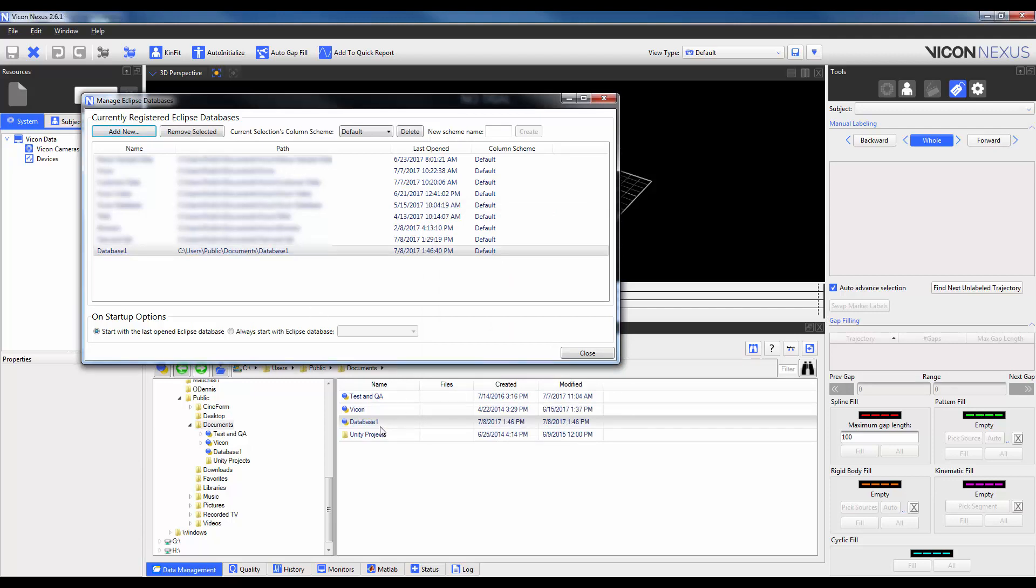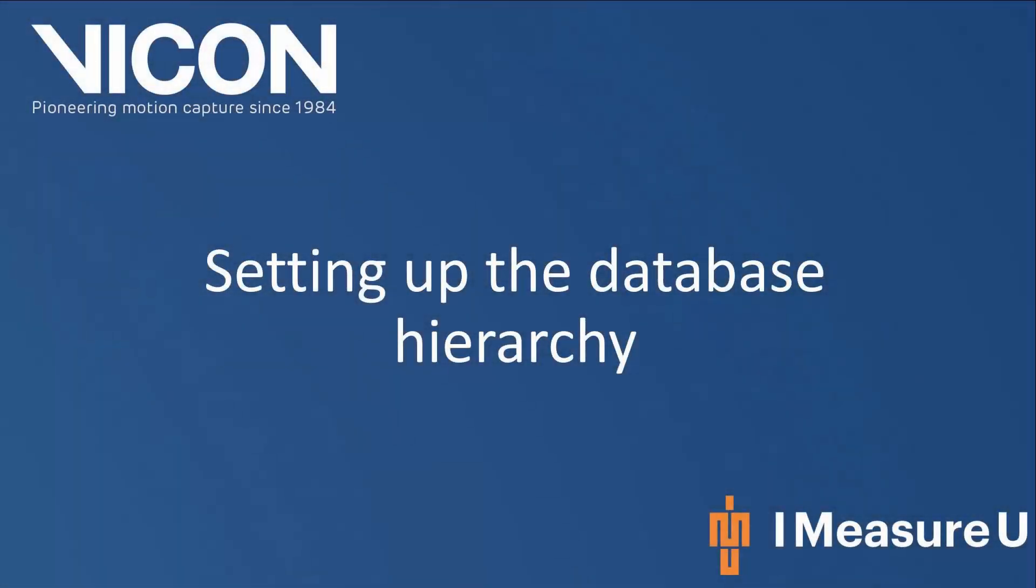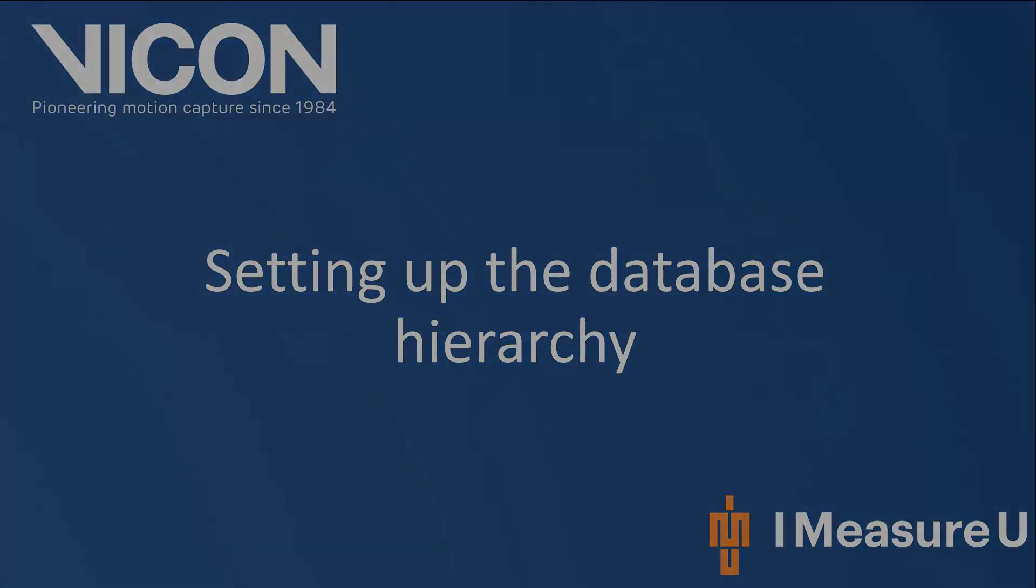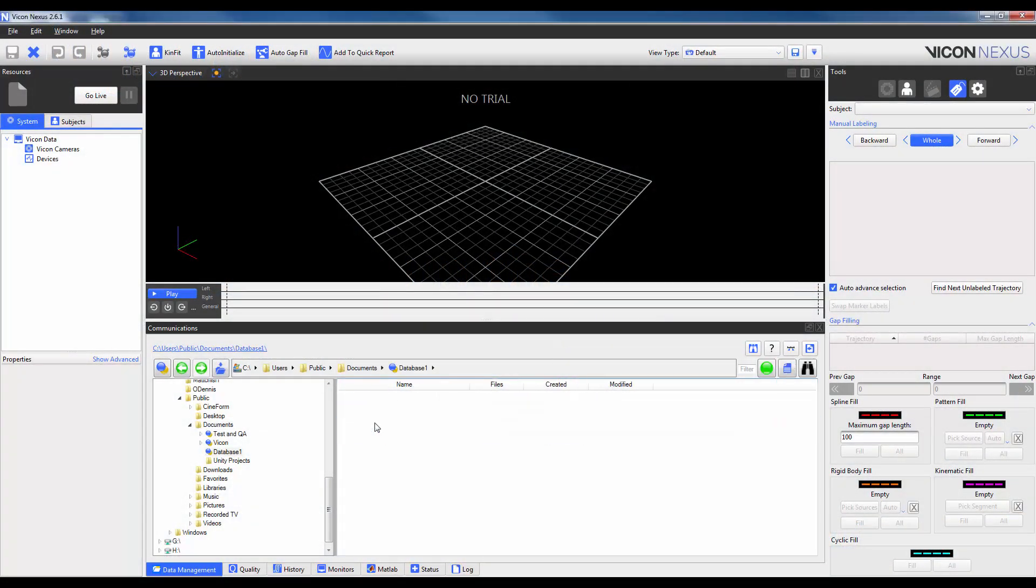I will now see that my database is in ProEclipse and that it has been registered within this interface. To open the database, I will double click on Database 1. Now I have my choice of two parallel hierarchies that I can use to organize my data. I will start with the most traditional one first.